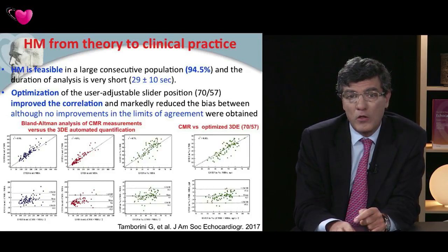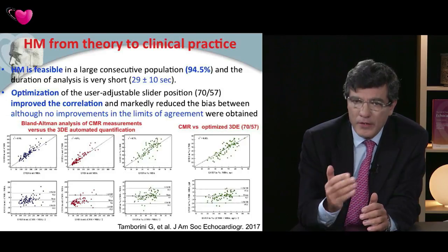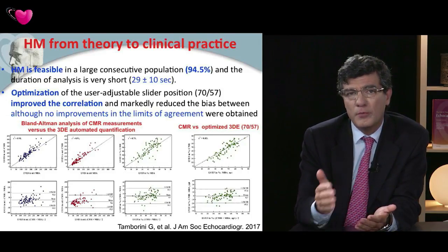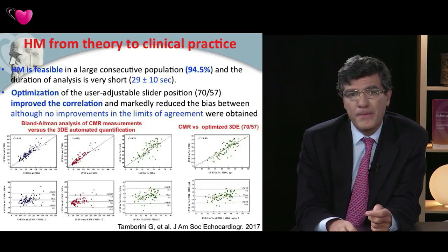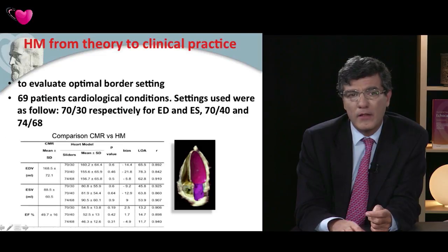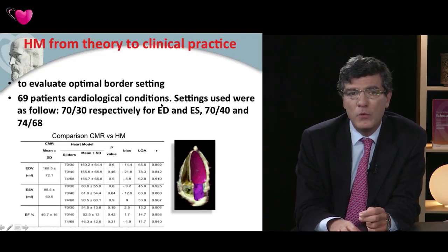Well, also, I think that it's very important if we use the adjustable slider position, whether this really interferes or is related to the optimal result of the technology. And in fact, this is what we did in our study. We analyzed almost 70 patients with different conditions, and we adjusted the settings to the different possibilities.